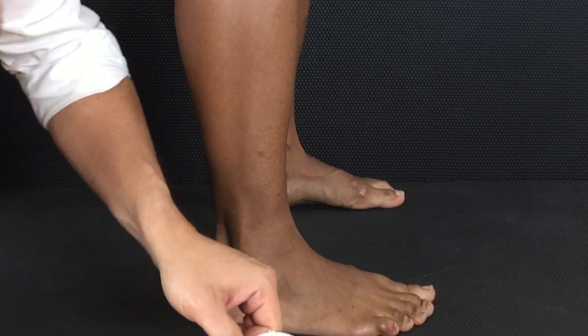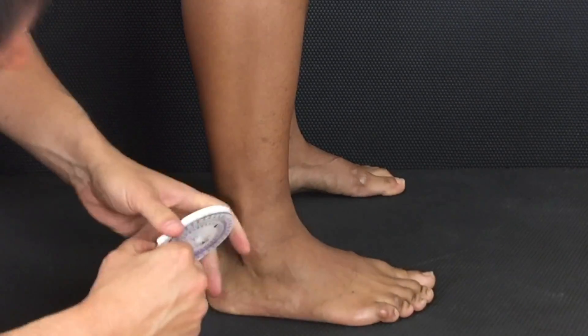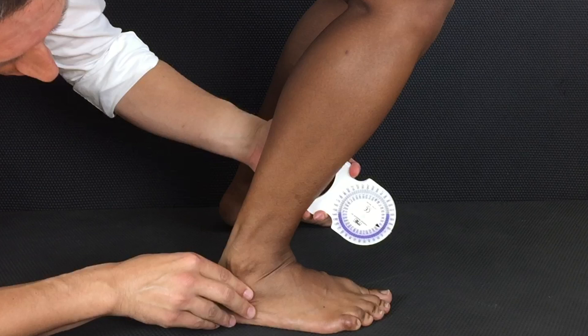You want to put the inclinometer directly on the tibial shaft, not on the soft tissue of the anterior leg. Make sure the calcaneus stays firmly on the ground and have the patient squat and take the measurement. This is a gross dorsiflexion measurement — it includes the rear foot, the mid foot, and the forefoot.